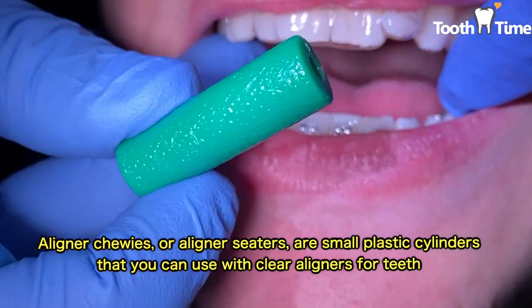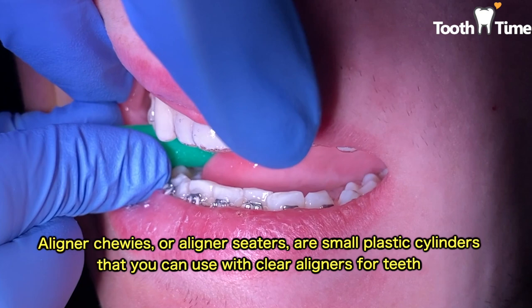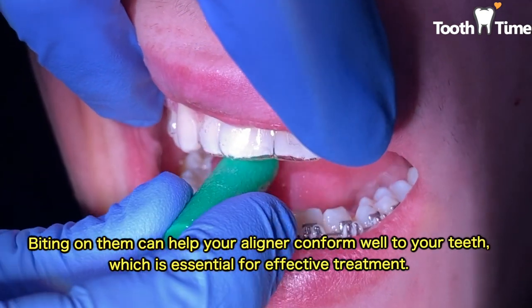You can also see that I had the patient use the chewies, and the chewies are like really hard rubbers that help seat the clear aligners into place.